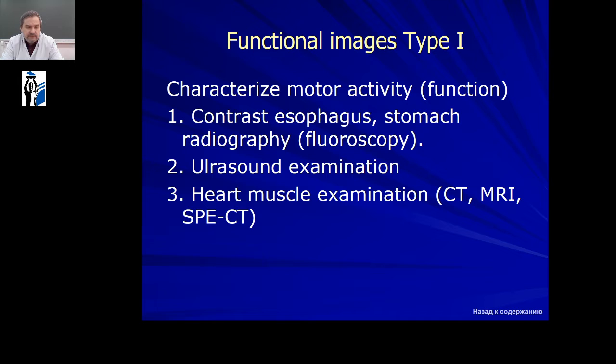The second example is all ultrasound examinations. And third, it's heart muscle examination by computer tomography, magnetic resonance images, and single photon emission computer tomography.